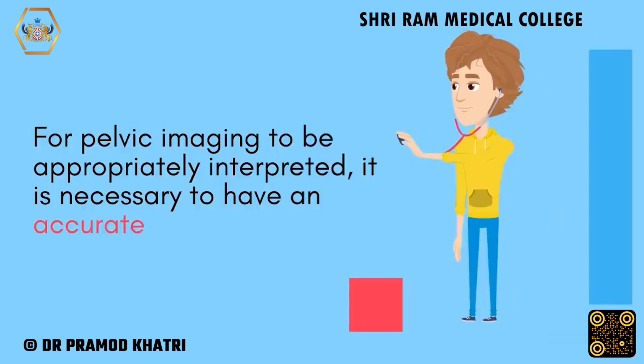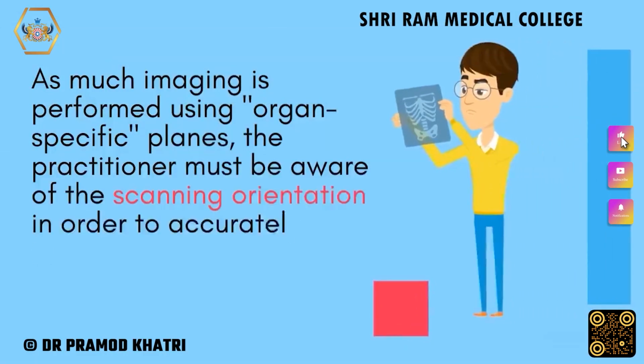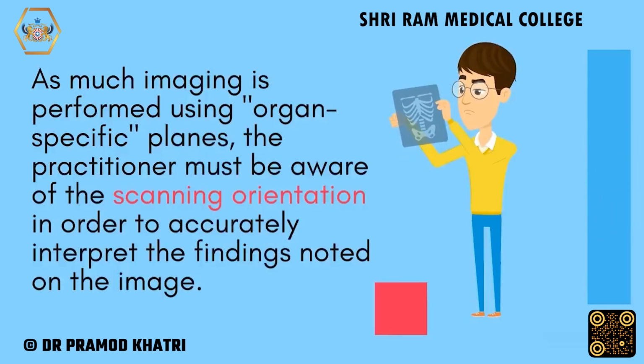For pelvic imaging to be appropriately interpreted, it is necessary to have an accurate orientation. As much imaging is performed using organ-specific planes, the practitioner must be aware of the scanning orientation in order to accurately interpret the findings noted on the image.